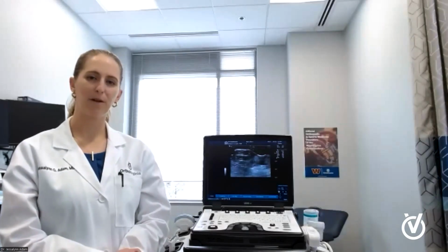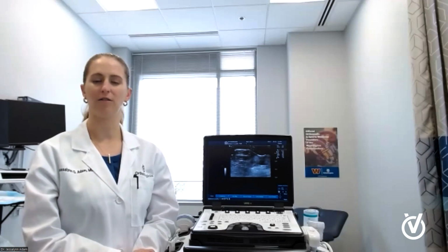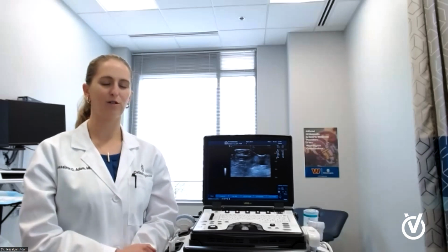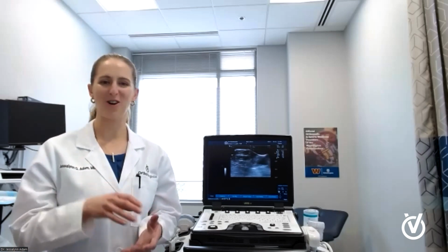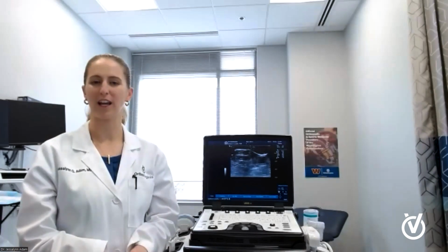Thank you. Is ultrasound useful for diagnosing neuropathy or other nerve issues? It can be. Neuropathy is something where you often need multiple tests to evaluate. And so I think ultrasound can be part of that evaluation. There are other tests like nerve tests and EMGs that can be really beneficial. So I always use the analogy, ultrasound is like back in the day when phones would be on the hook or off the hook. An ultrasound or an MRI can tell you if the phone is on the hook, and something like a nerve test or an EMG can tell you if it's ringing.